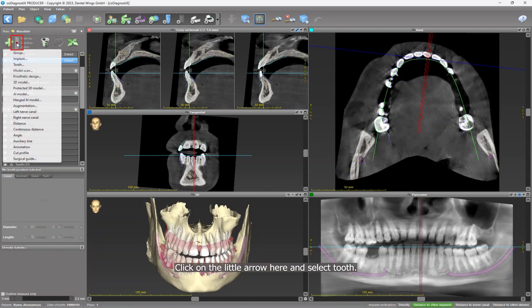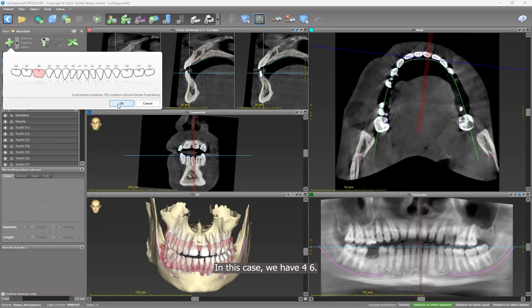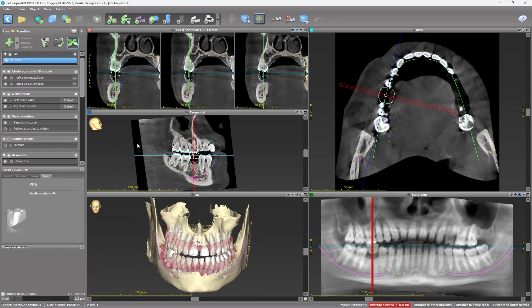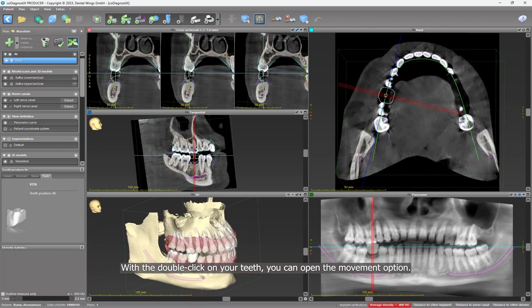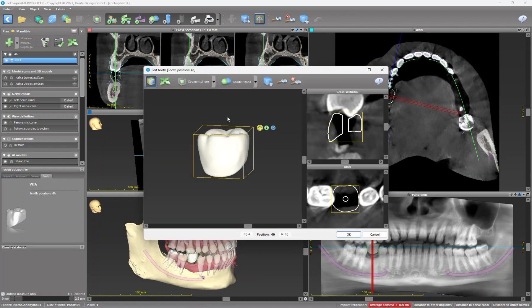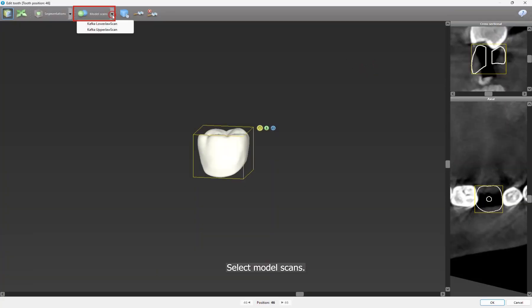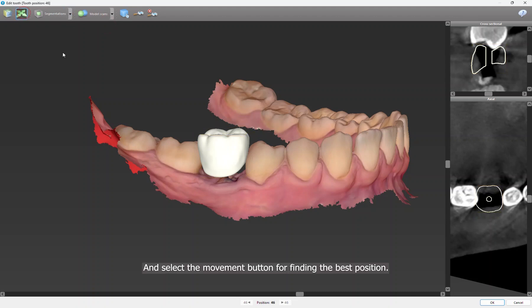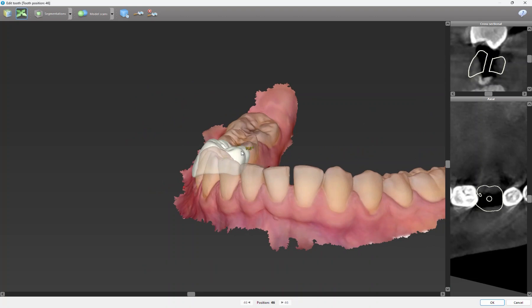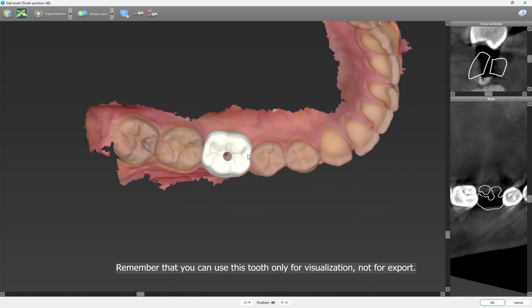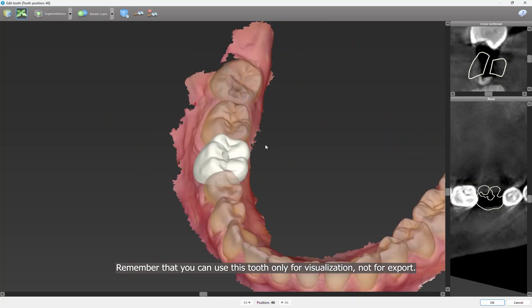Click on the little arrow here and select Tooth. You can select as many teeth as necessary. In this case we have four six. With the double-click on your teeth, you can open the movement option. Select Model Scans, and select Movement button for finding the best position. Remember that you can use this tooth only for visualization, not for the export.